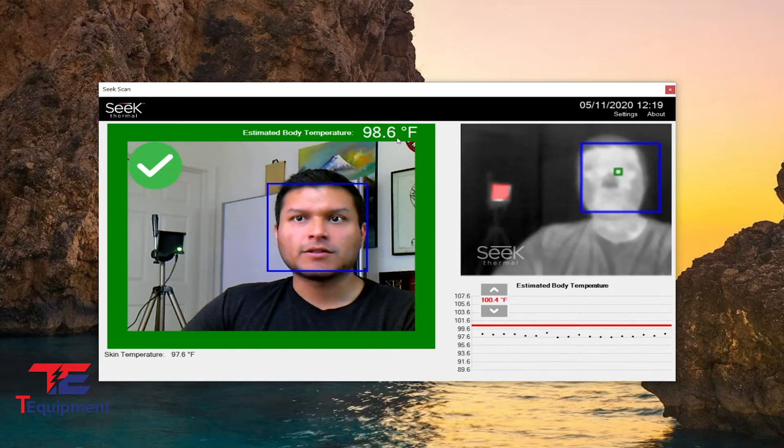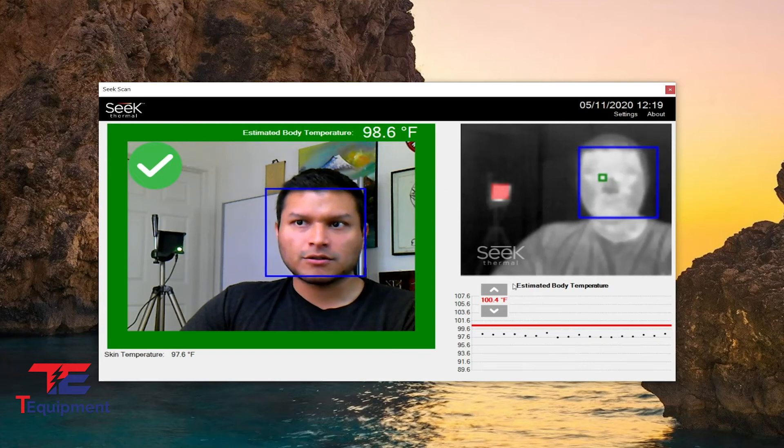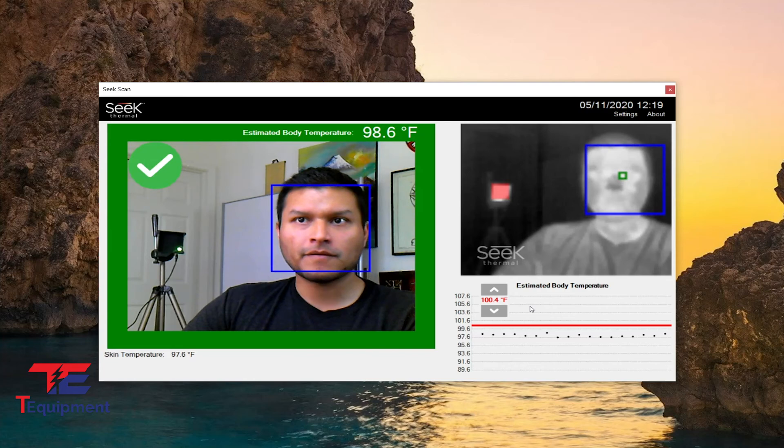If I had kept that additional 2 degree offset, I would have been at 99.6, perhaps a little bit higher, which is dangerously close to the 100.4 degree Fahrenheit threshold for a fever. I do not have a fever, so this is actually the best range you can have here.